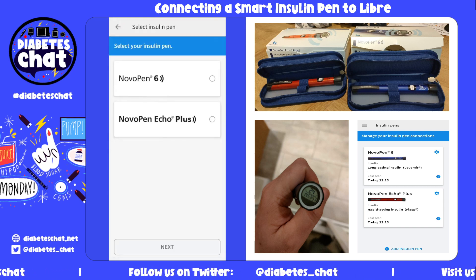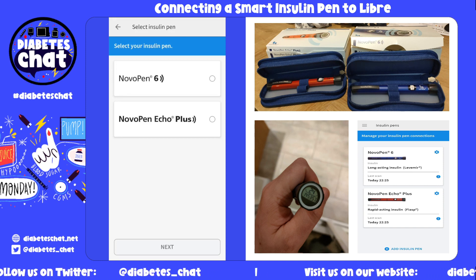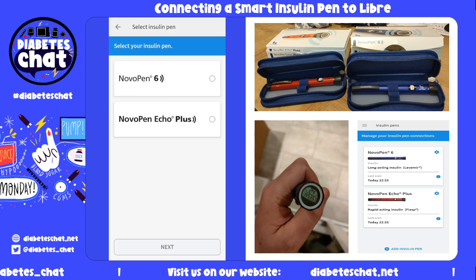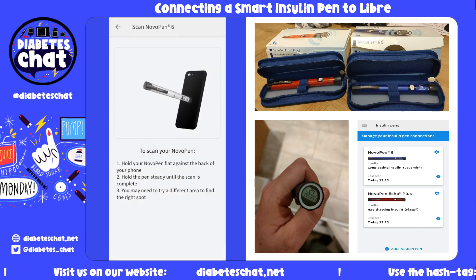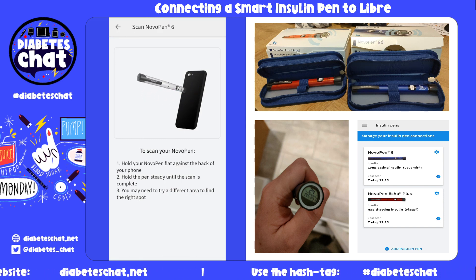So let's get started. I'm going to choose your pen — currently the Novo Pen 6 and the Novo Pen Echo Plus are compatible on the app. I'm going to install my Novo Pen 6, that's my long-acting insulin. You are going to scan your Novo Pen to the back of your phone, so make sure your NFC is enabled.